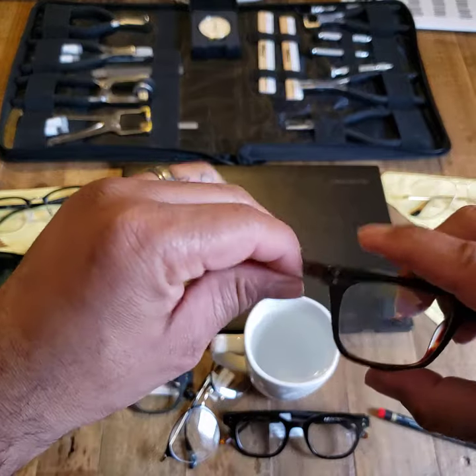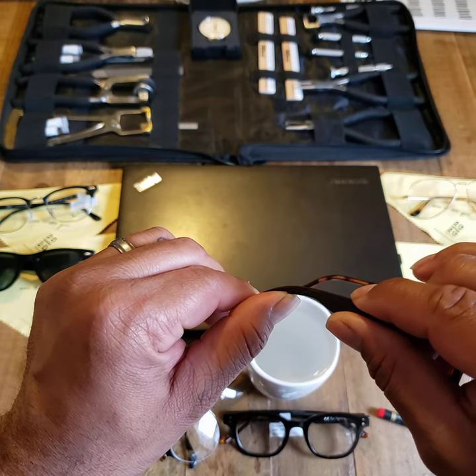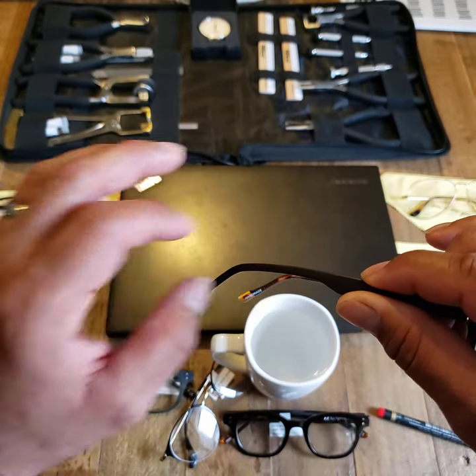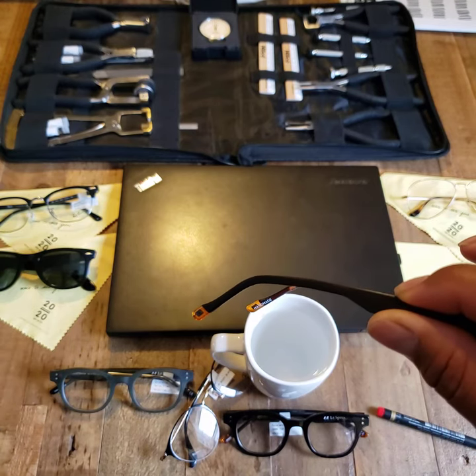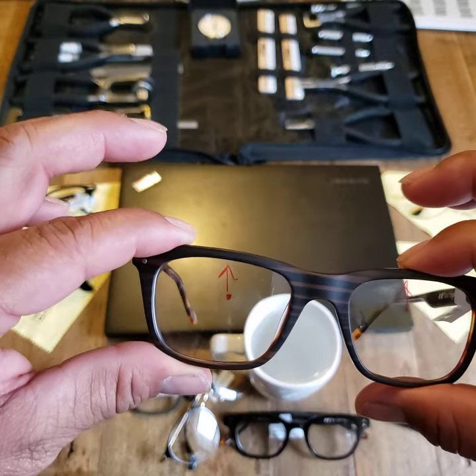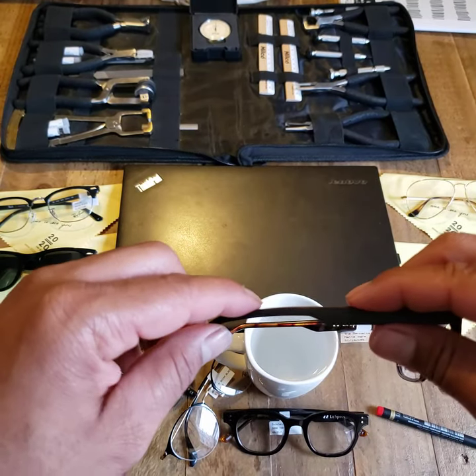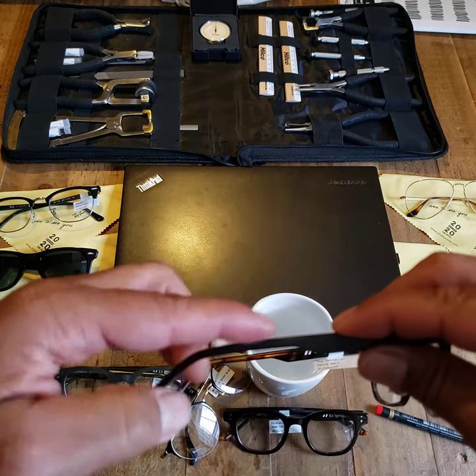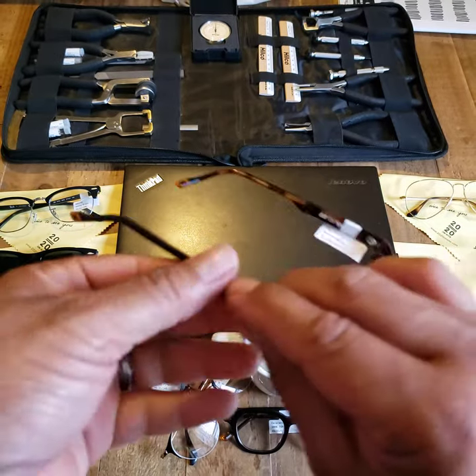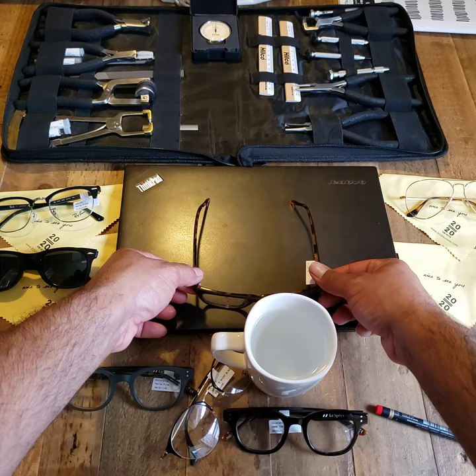So if I wanted this side to go up, I take the temple and manipulate it down. I went quite a bit more than I wanted, knowing it will flex back up a bit. Keep in mind we're looking to adjust just millimeters — just a fraction of an inch. That would then raise this side up. And if I wanted this side to go down, I'd warm it up the same way. I'm pushing down and using my thumb and middle finger to pull up, to get just a little bit of movement. And as we can see now, they're far more even.